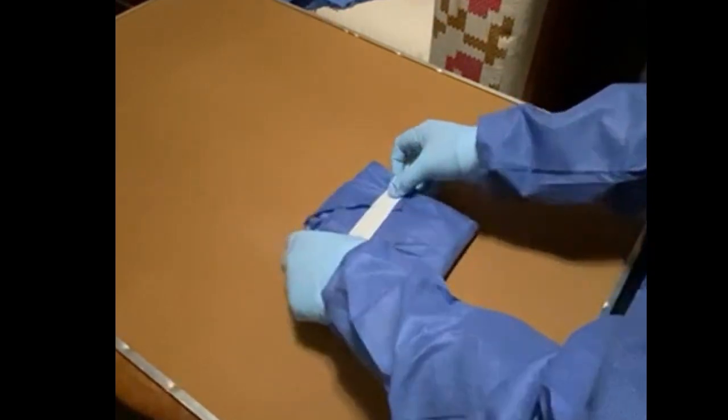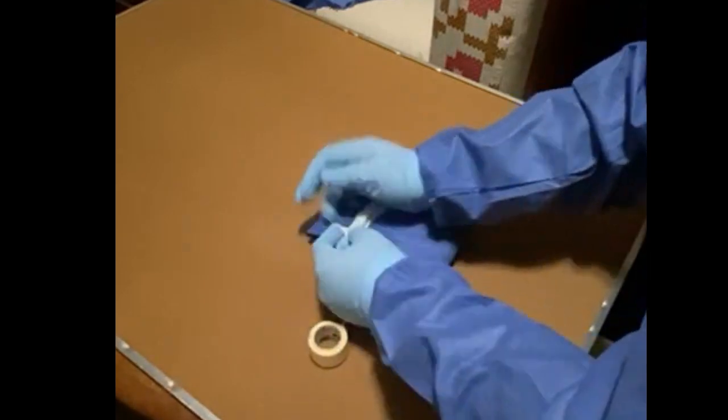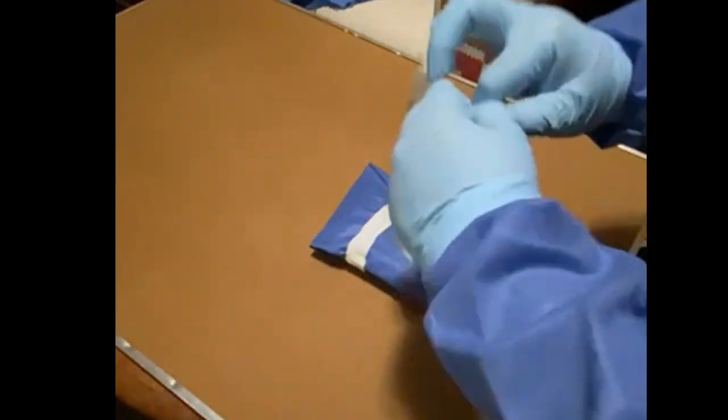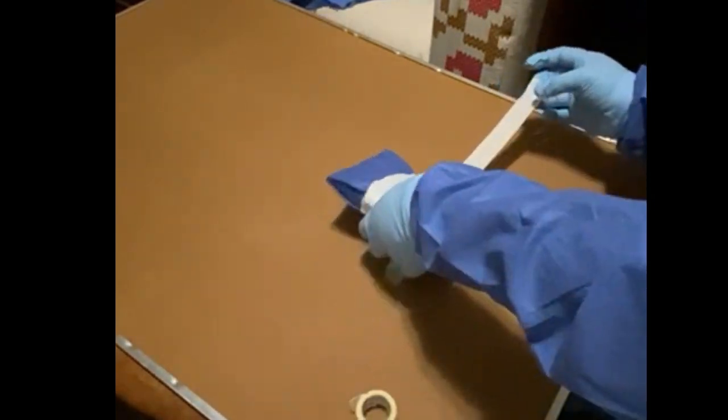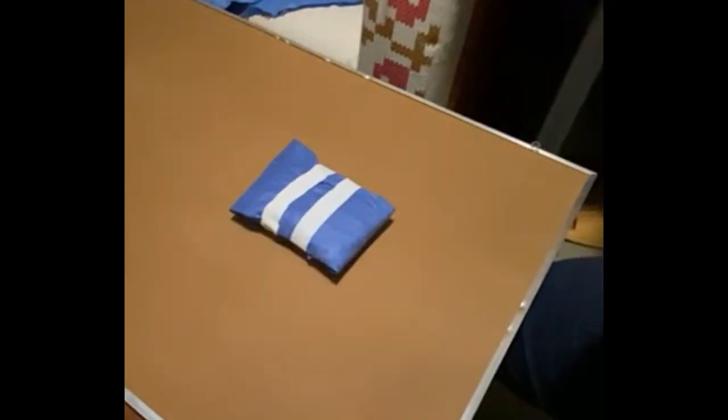Use sterilization indicator tape or special adhesive seals to secure the last fold in place. Wrap the tape around the final folds to hold the package together. Ensure that the tape does not obstruct the opening of the package but secures it snugly.